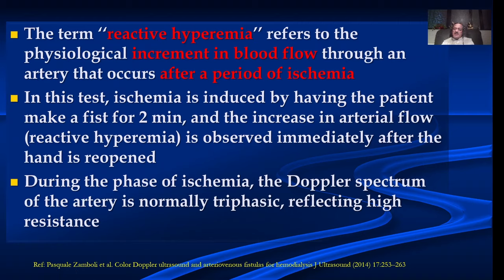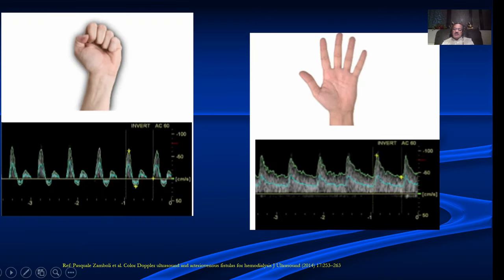There is a test known as reactive hyperemia, done typically before fistula planning. We are looking for an increment in blood flow after a period of ischemia. This test tells us whether the artery is able to dilate adequately after ischemia — important because once a fistula is created, increased blood demand requires the artery to cope. We ask the patient to hold the fist tight and evaluate the radial artery, seeing a very high resistance waveform, then ask the patient to release the fist — typically we then see an increase in diastolic flow, indicating the artery is good for dialysis.